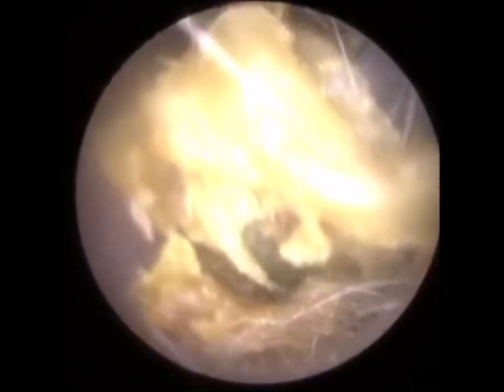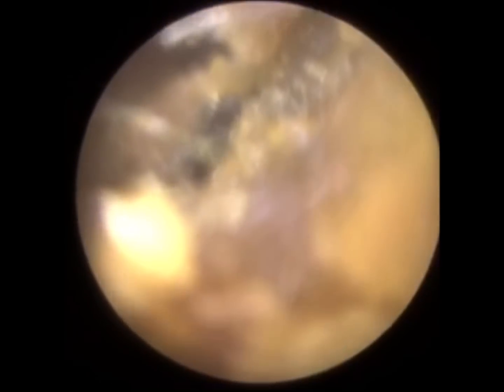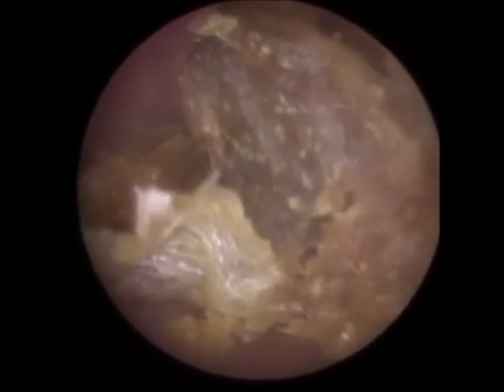It could have been there was just more wax being secreted in the right ear, which caused more of an acoustic seal. So with this left side, the ear canal wasn't fully occluding. I would say it's 3/4 occluding, semi-occluding. So there was some air going into the ear canal, which could have helped dry the ear in some respect. With the right side, the ear was completely blocked, and that could have caused a lot of sweat and humidity within the ear canal, which turned the wax a bit more mushy. So that's one plausible explanation.